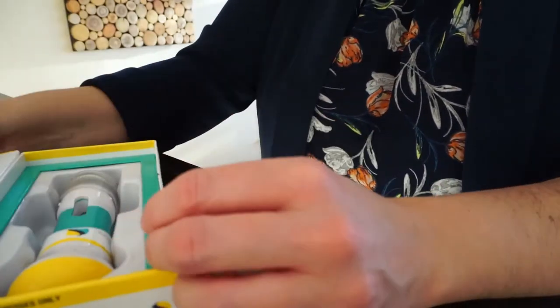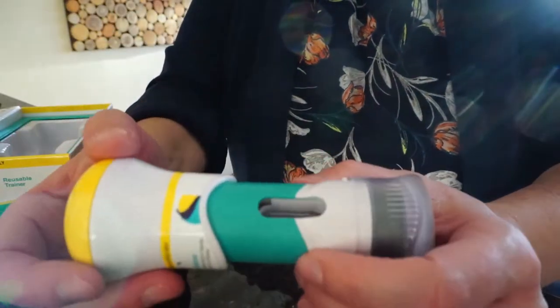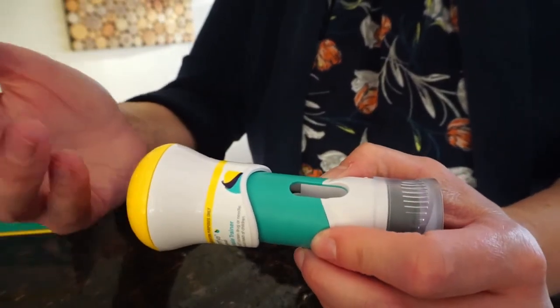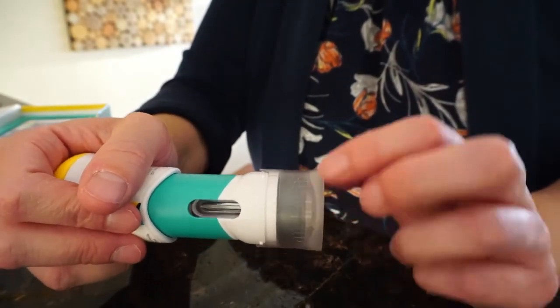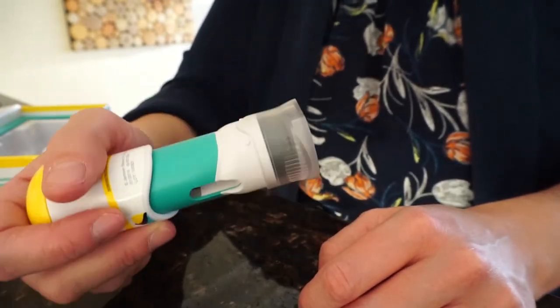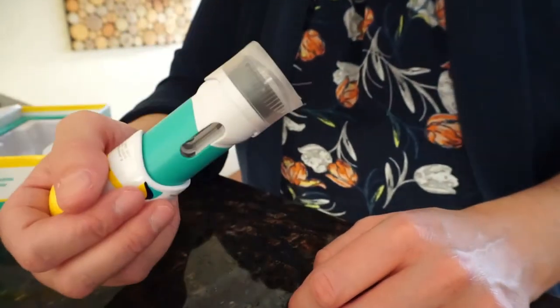You'll open up the box and you'll get this pen. What's really cool about this pen is that it's very ergonomic, so if anyone has dexterity issues, it's very easy to manipulate. The nice thing also is that you will never see the needle with the Tremfya pen — so if you have a fear of needles, you won't see it; you'll get injected, but you won't see the needle.